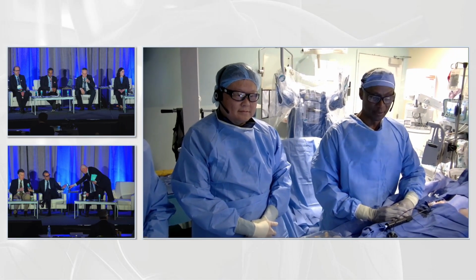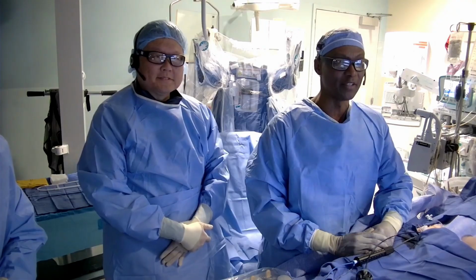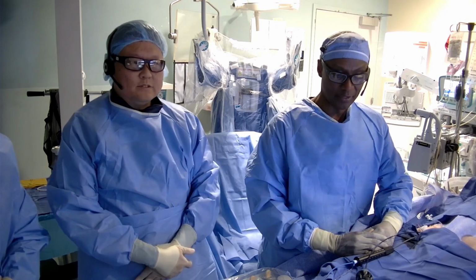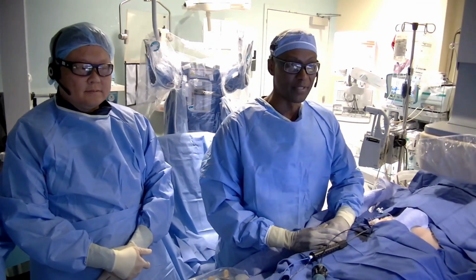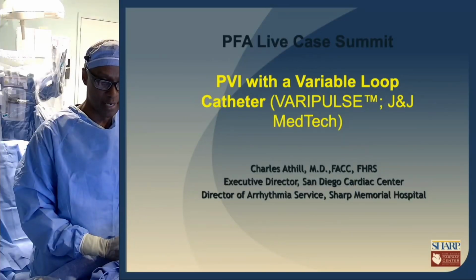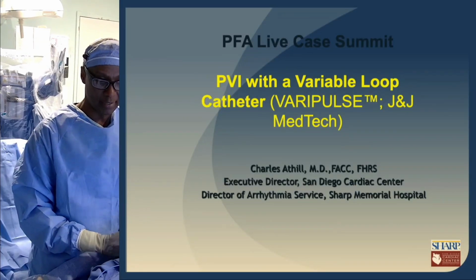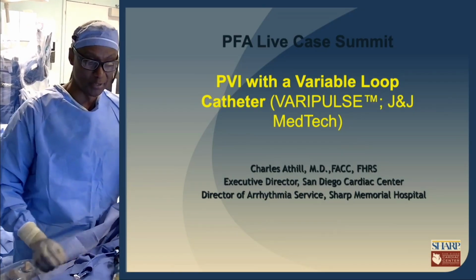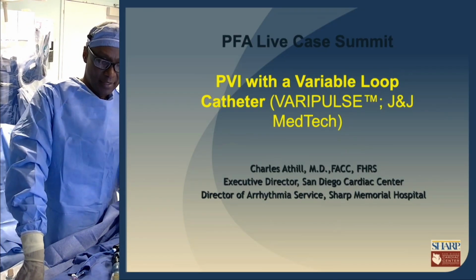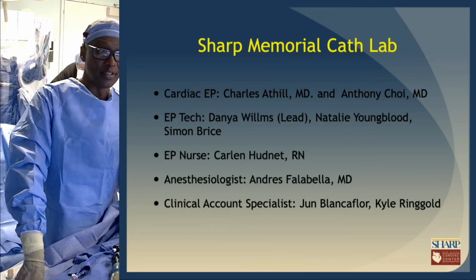Good to have the audience who sat through the entire day of cases, and we're happy to present to you a case using the Variable Catheter. Thank the organizers for inviting myself and our lab to present this case. And we'll go ahead and get started with just the case introduction. First slide just shows the people currently involved in presenting this case to you.